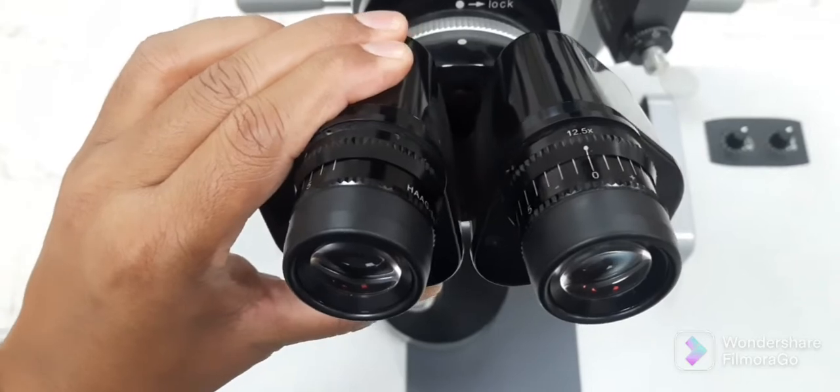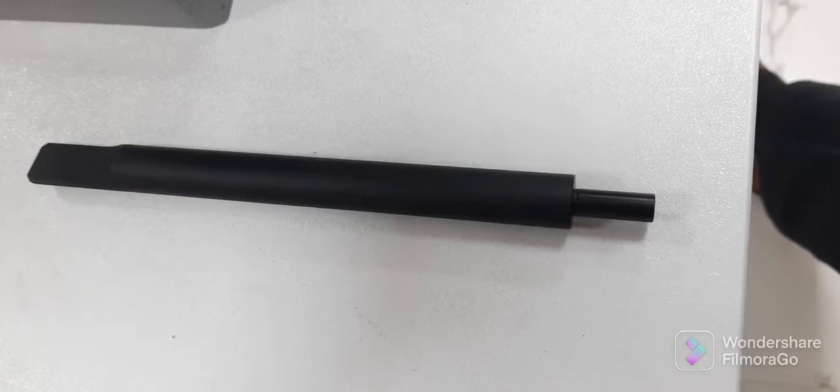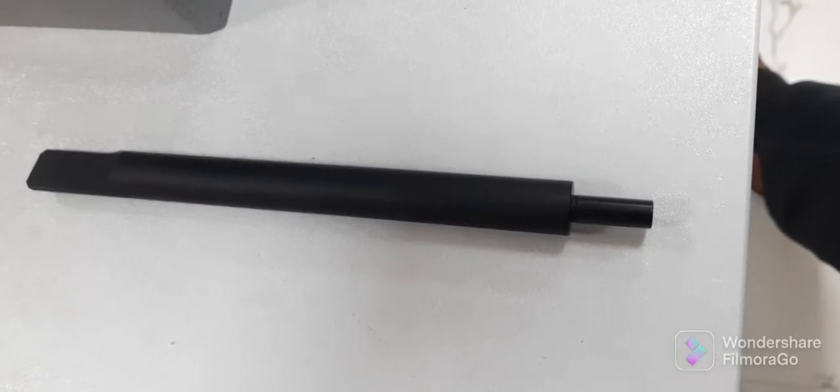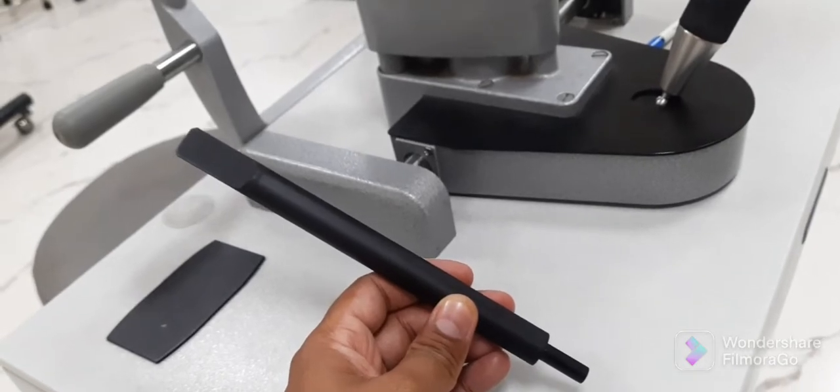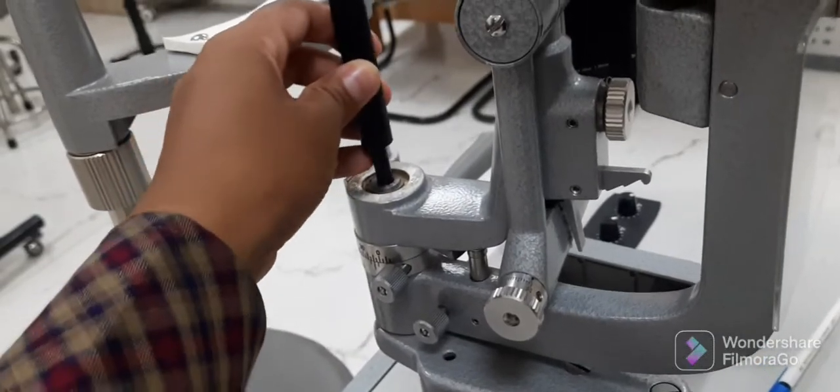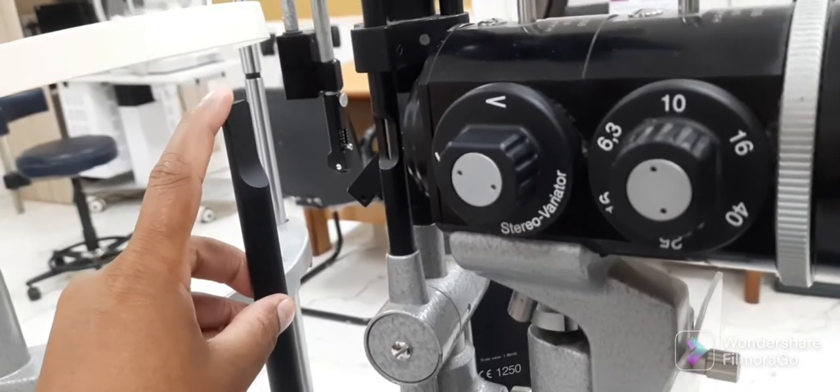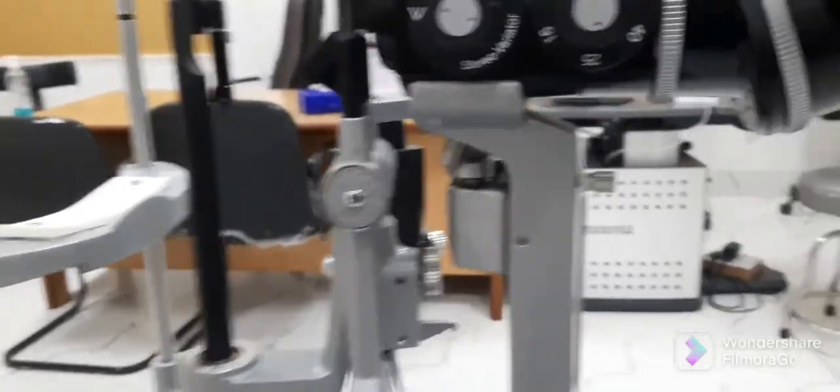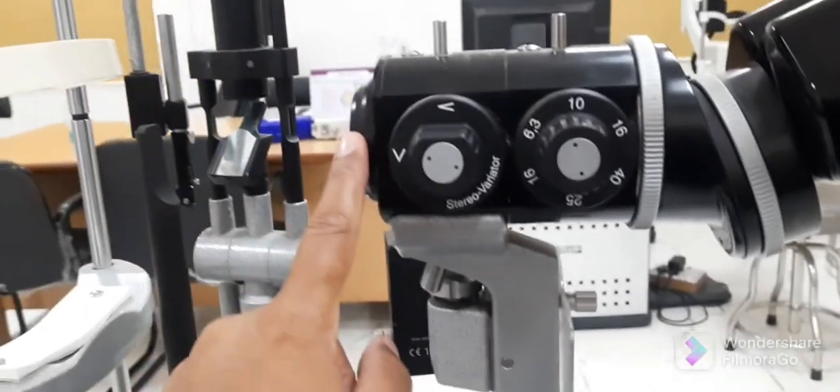This is the focusing rod which is used as a target to focus both the eyepieces of slit lamp before examining the patient. It is inserted on the slit lamp on the coaxial arm properly adjacent on the mount, so that its plane surface should be perpendicular to the observation arm or perpendicular to the lens of observation arm.